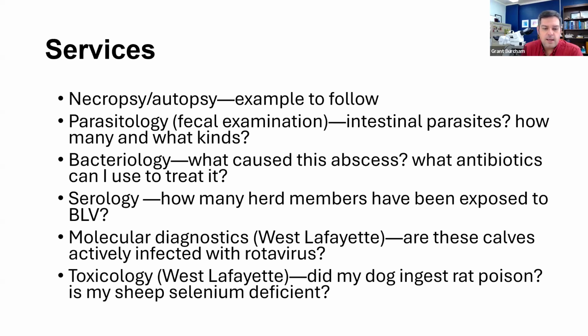Molecular diagnostics, this is the cutting edge, if you will, of diagnostics in general. So these are tests that examine for DNA or RNA of infectious agents. So it's not limited, for example, to just bacteria, but viruses, parasites, any sort of infectious agent that has DNA or RNA. So for example, we can ask the question, are these calves actively infected with rotavirus, for instance, or insert any disease name that you want.